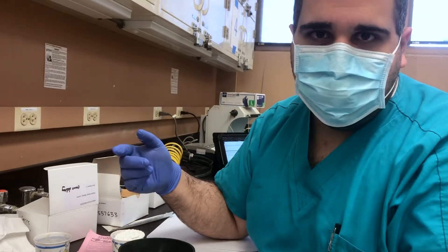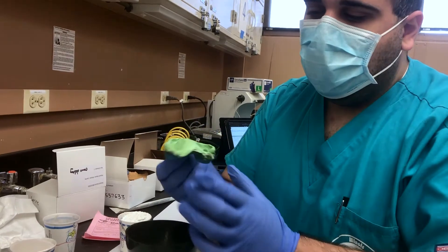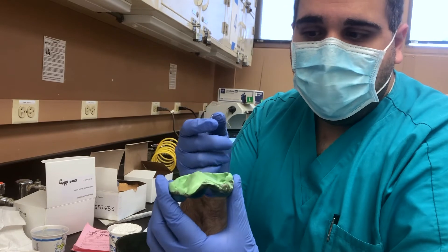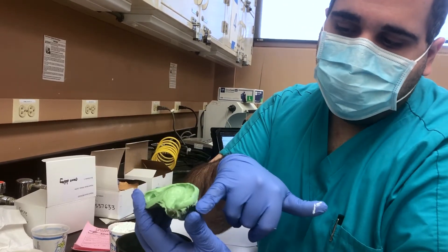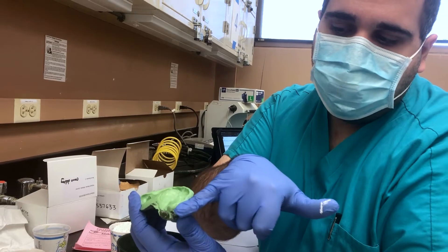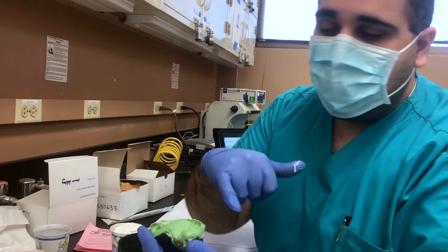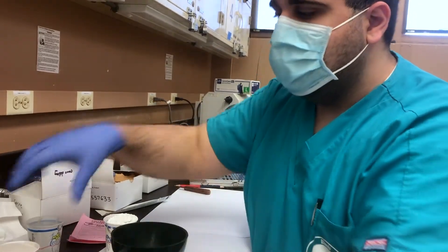The goal here is to submerge this impression in the pumice-plaster mixture until there is only about two to three millimeters of your flange showing all the way around. If it goes a little deeper, it's okay — we can cut off the pumice mixture afterwards.